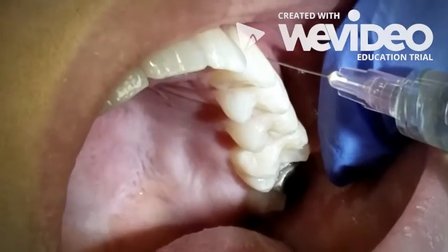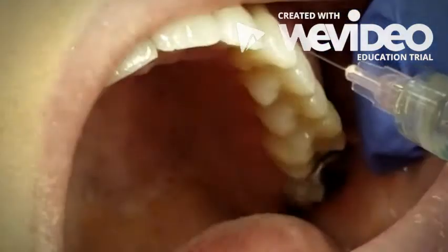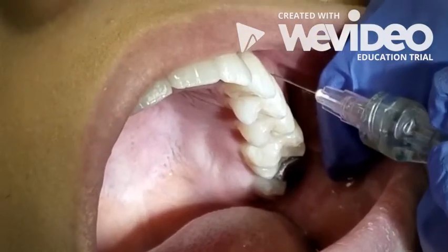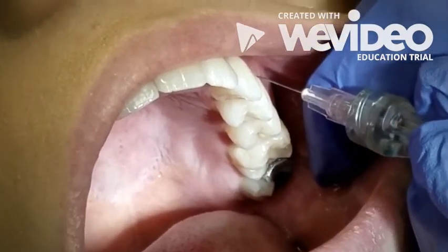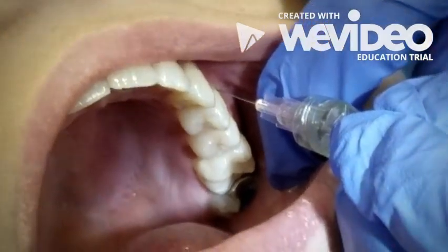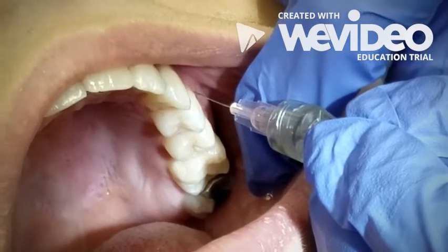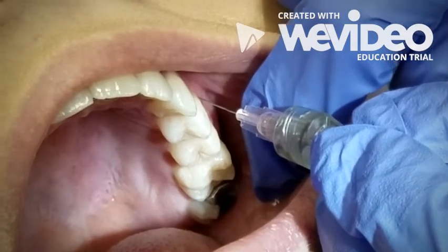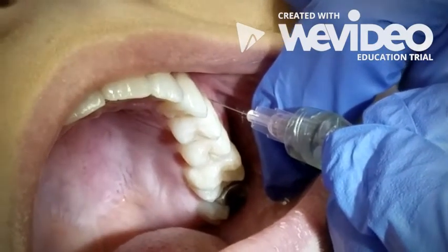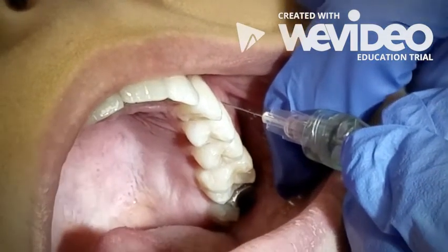First, we'll advance the needle apically until resistance is met, then establish an anesthetic pathway in the sulcus or pocket. Once established, you will then puncture the junctional epithelium and then aspirate. We give a 1/2 cartridge of anesthetic for this injection with the extra short needle, and it should last for about an hour. This injection is beneficial because the onset is rapid. The patient lacks collateral numbness of the face, tongue, and lips. We can see the tissues both facially and lingually are blanching, indicating success in anesthesia.